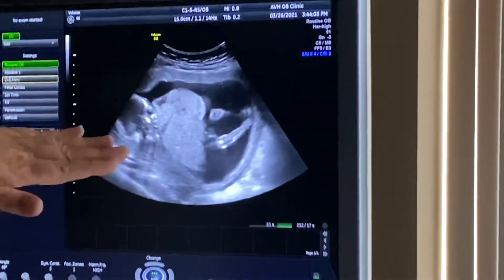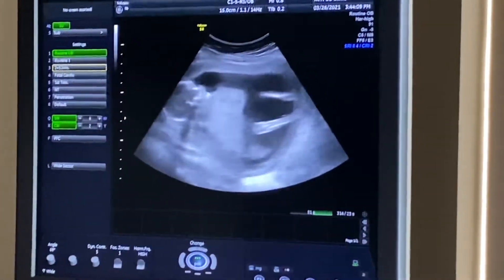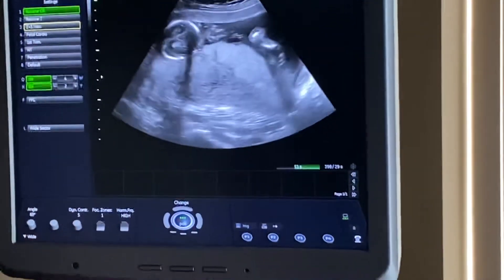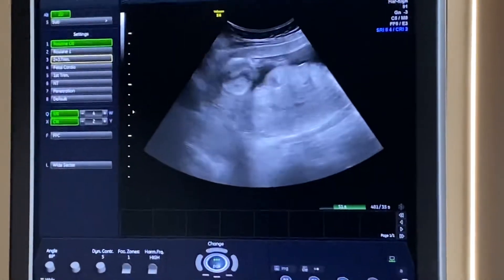It's making a picture through the placenta, so we can... He's on the other side, and you can see... He's pretty big. All those feet kind of wiggling around in there. Here we go. This is a better picture. A little bit better there for a second. Let's see if I can get it again.